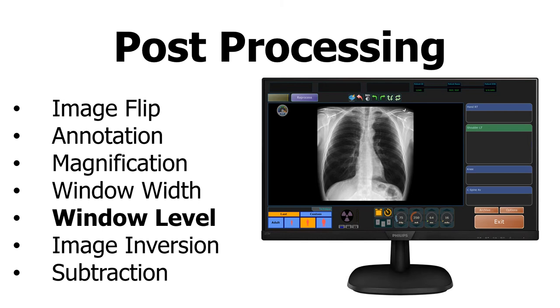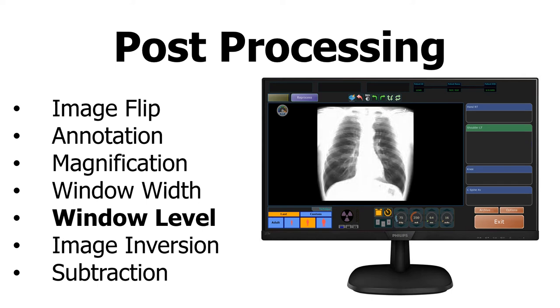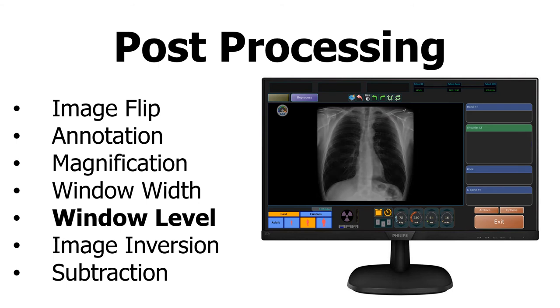Window level adjusts brightness. Usually, you can hold down the left mouse click and move the mouse side to side to increase brightness or decrease brightness.